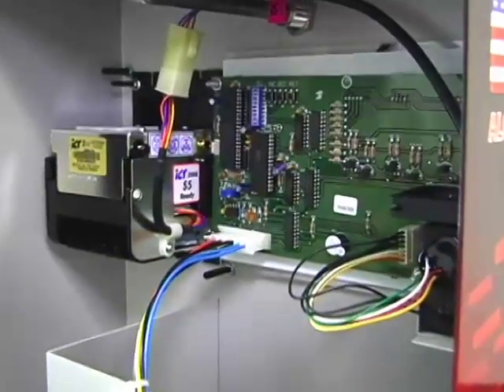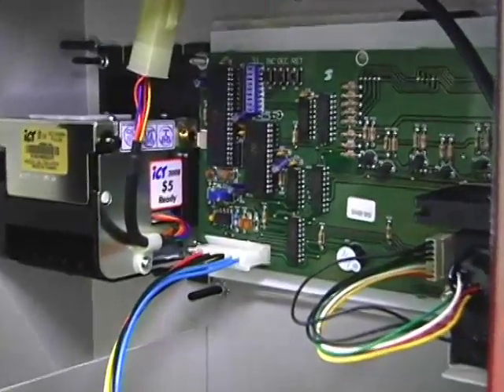Now that the solution is created, I'm going to show you how to put the AlcoBuddy into calibration mode. Now that we are inside the machine, let me show you how to put it in calibration mode.